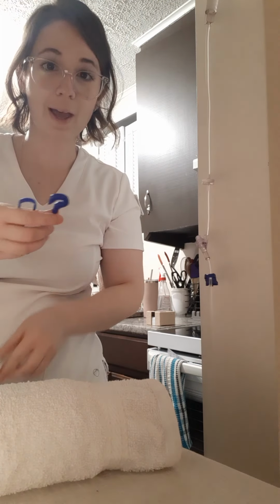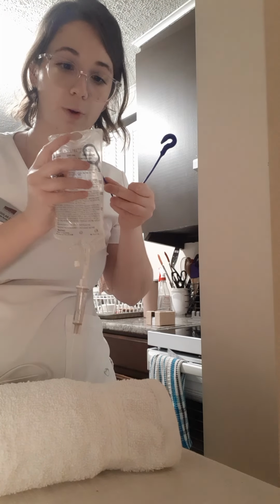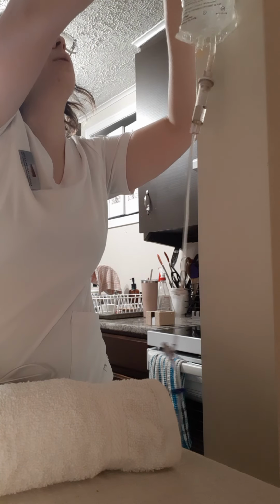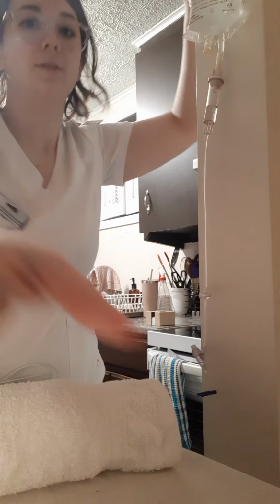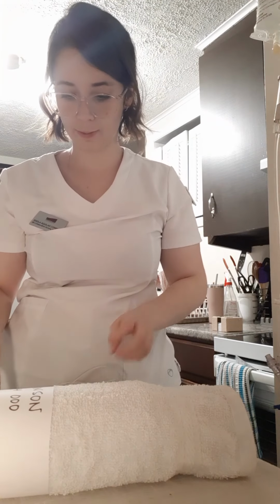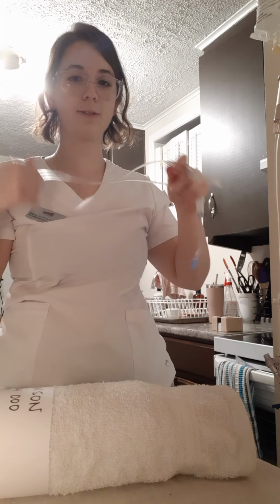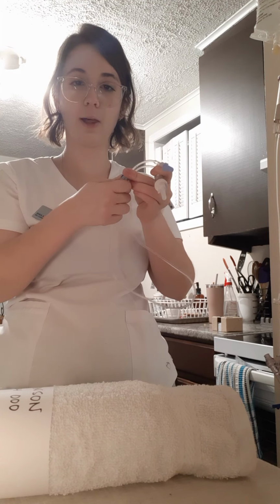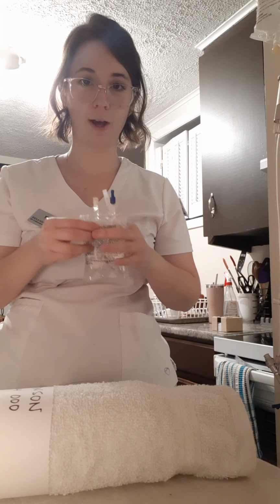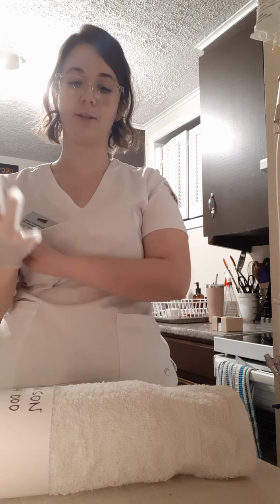So I'm going to open my supplies and make sure I put this on before, because we're working with gravity, my primary line has got to be lower than my secondary line. So I'm just going to put that there as such. And I'm going to make sure that this is clamped and closed. Perfect. And now this is a sterile technique, so before I do anything else, I'm going to put my gloves on.